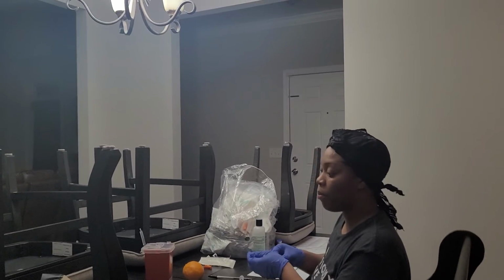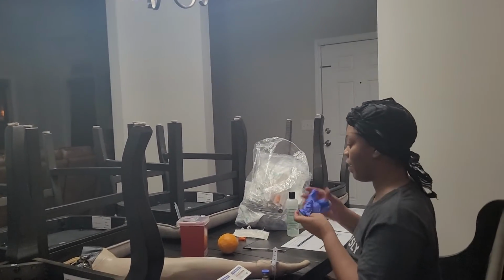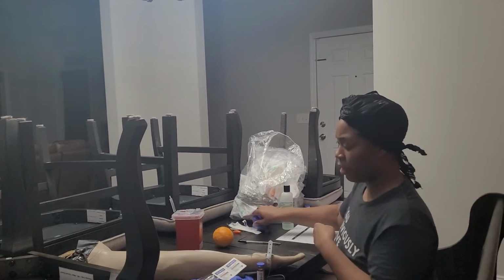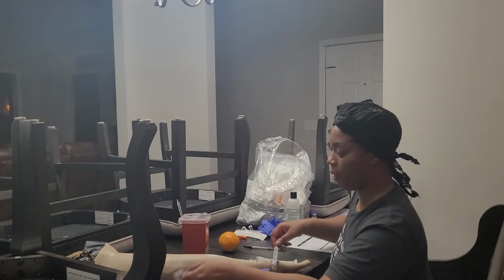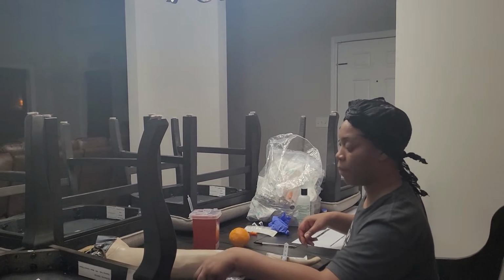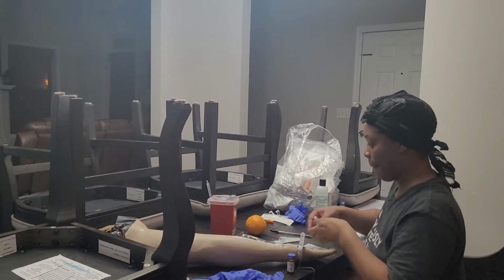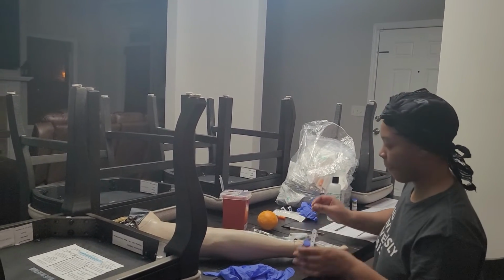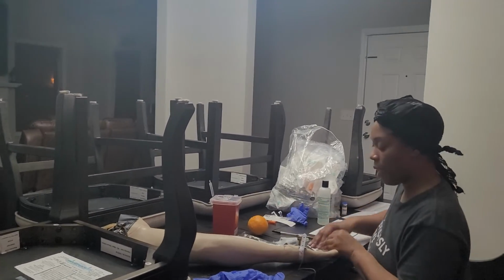And now I am going to go ahead and get rid of these gloves here, only because I'm bringing my other material over for our IV push medication. Setting up everything.